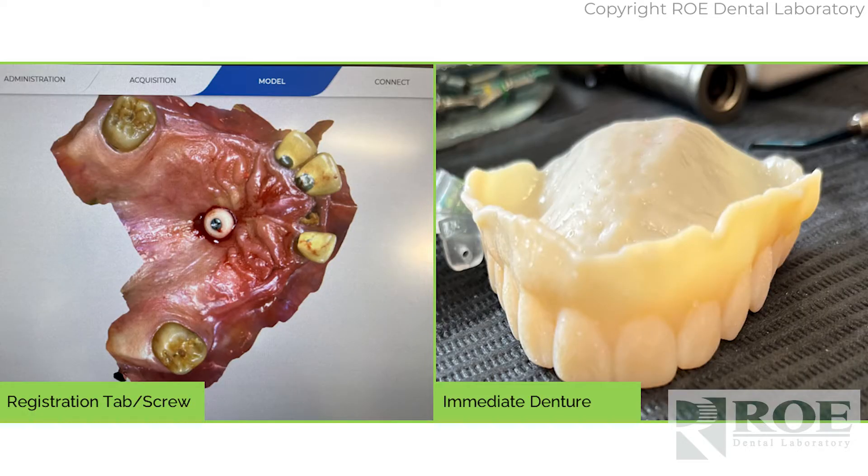When you start a photogrammetry case, there are two directions to go. One direction is to use a pin, tab, or screw in the patient prior to extraction — usually in the palate for the maxilla, or in the labial, buccal, or posterior areas. The idea is you have it before surgery and after surgery, and that's how you register the patient's bite before and after. Otherwise, when the teeth are gone, you lose the bite. The other way is to fabricate an immediate denture prior to surgery and use it as a reline to capture the ICAM or PIC scan references — the scan bodies. Dr. Sullivan went through both processes to demonstrate.